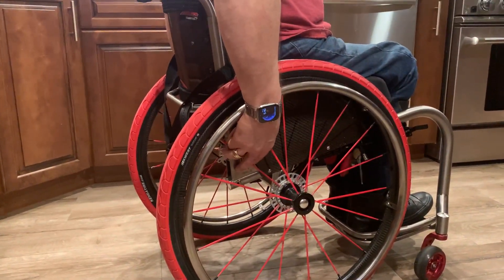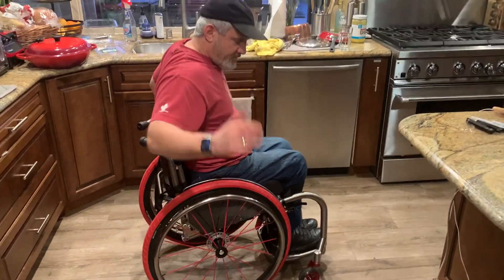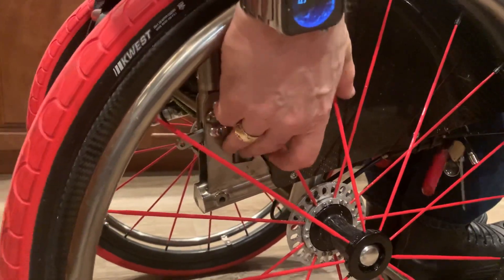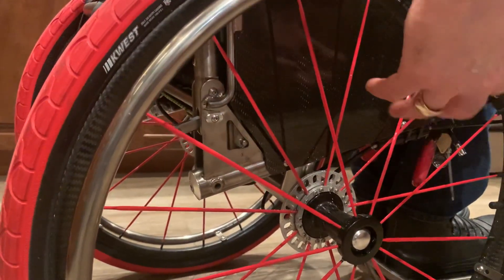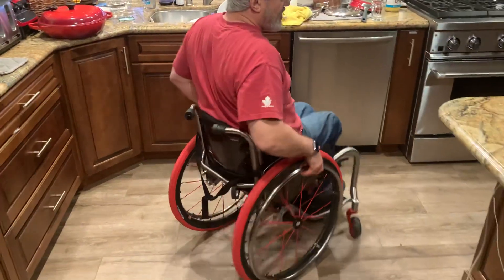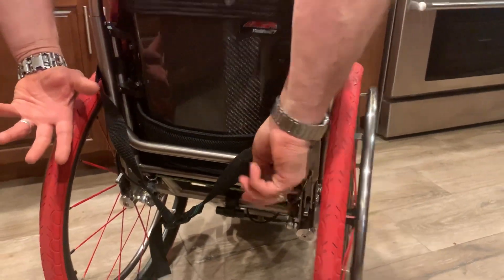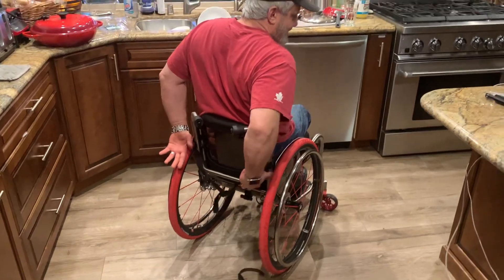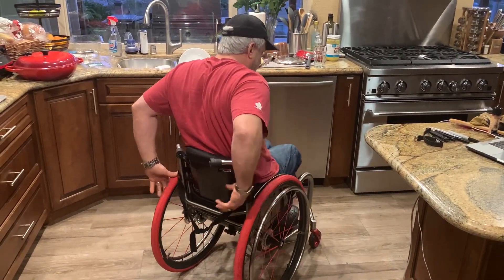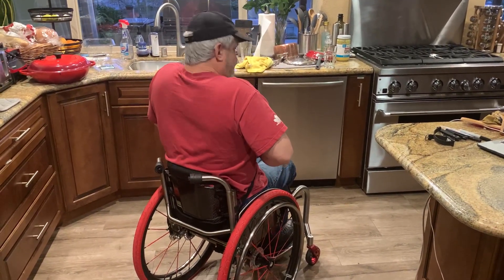Right now what's locking me down is a little switch — it's right inside this triangle here. That little button right there. I had to put that on because the lifters are kind of level with these buttons, so they don't press the lifters. The lifters want to come up. Let's get rid of this watch — there's nothing else back here.